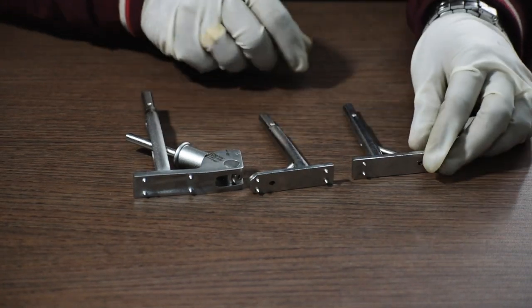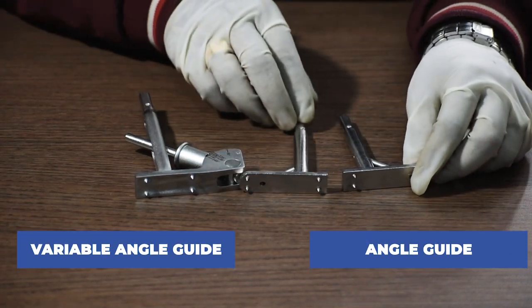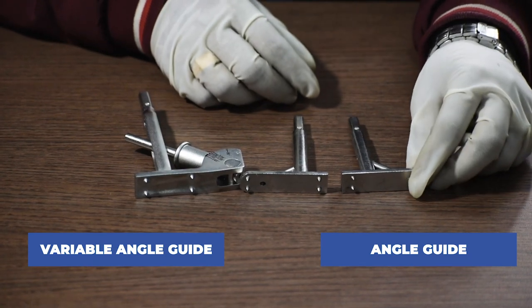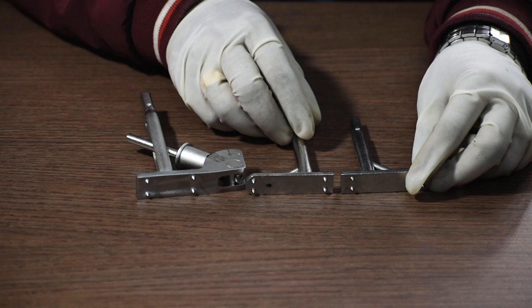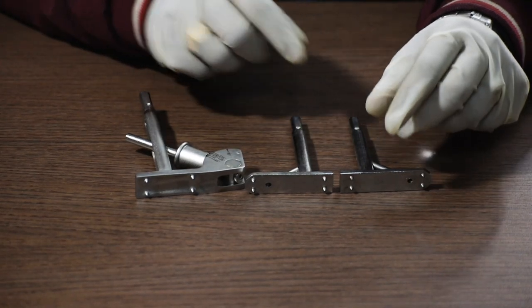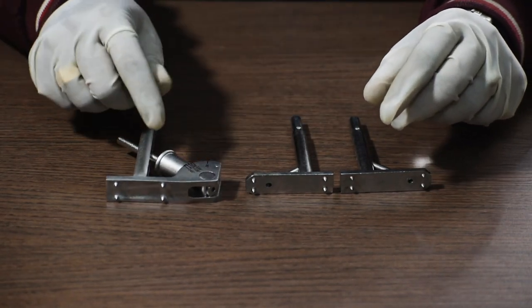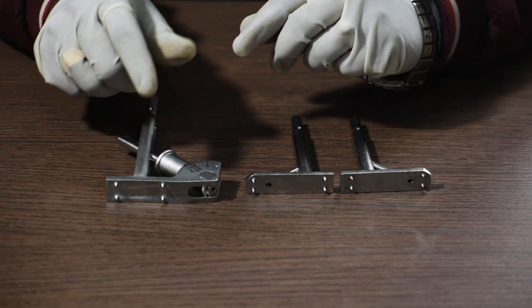So we start with an Angle Guide. These two are Fixed Angle Guide and this one is Variable Angle Guide. These Angle Guides are used to insert guide wires in the fracture site.